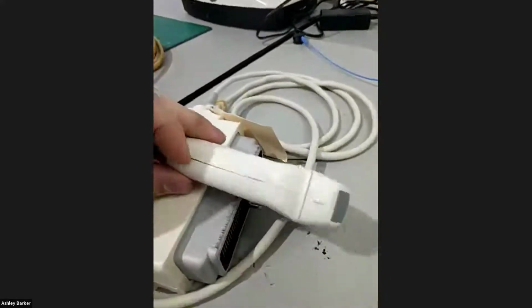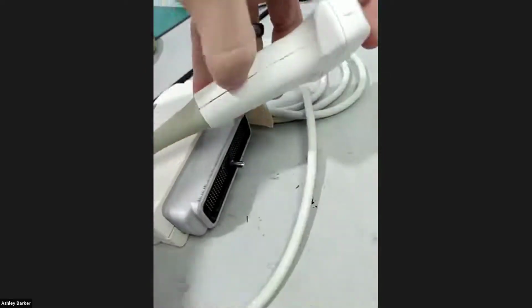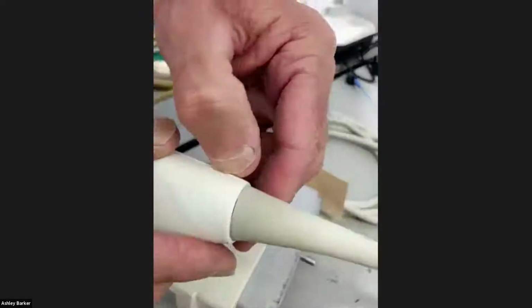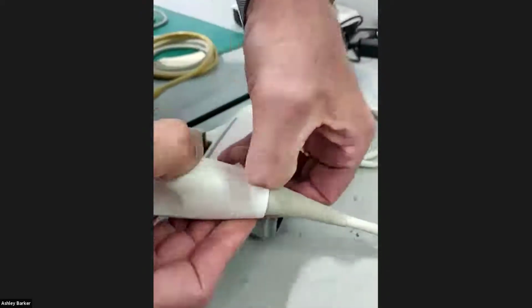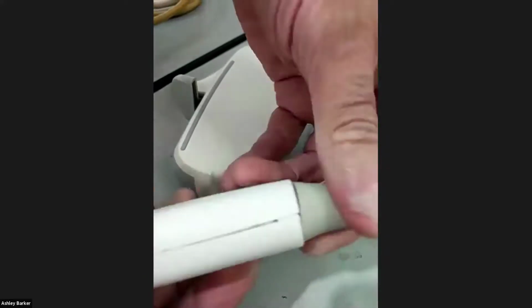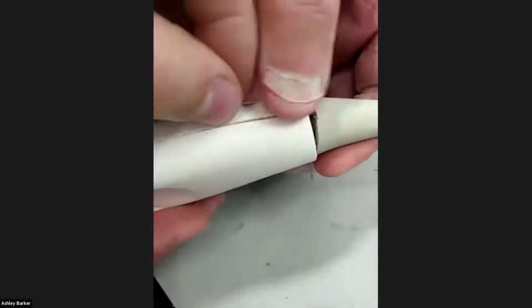This one here might be harder to see, and you've probably even seen them in the past, but it's a bit hard to do one-handed. Alan, are you able to just give that a pull? I've got some assistance here. Very good assistance. Yeah. So this is just the cases start to separate. And the back pulls off there. But you can see those cases separating.